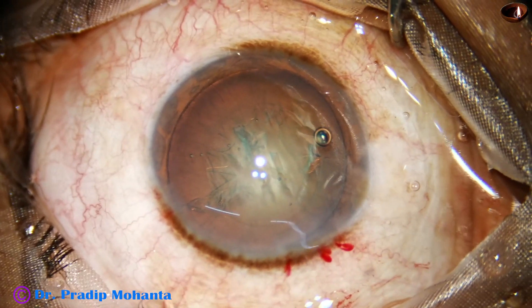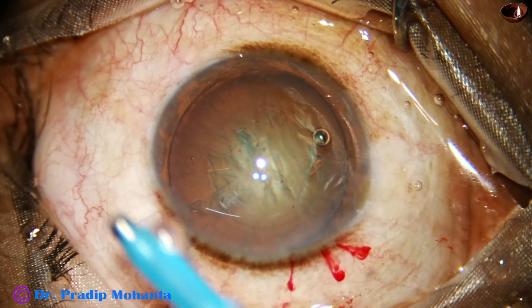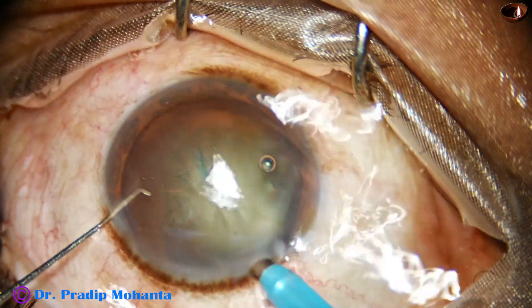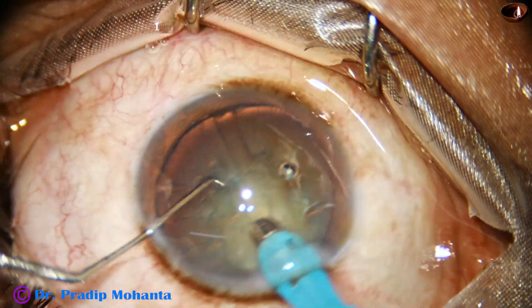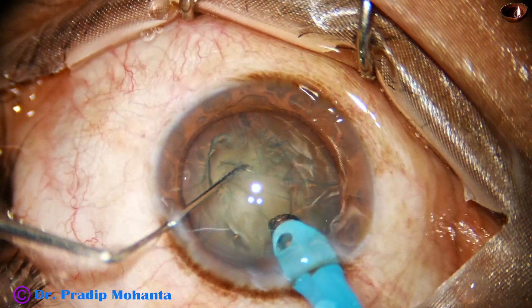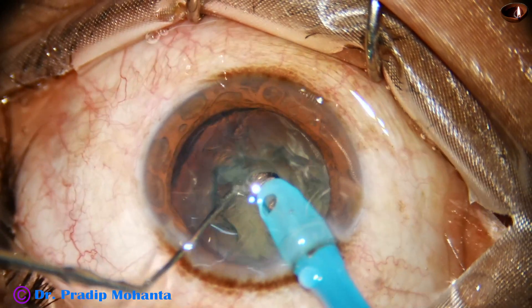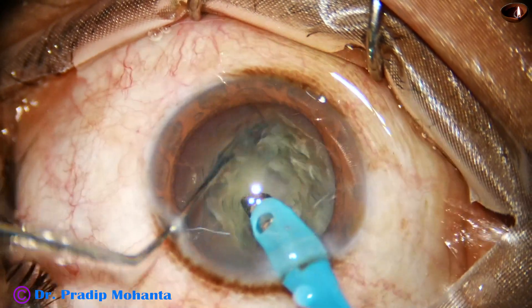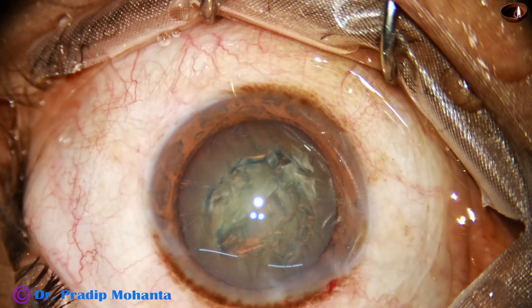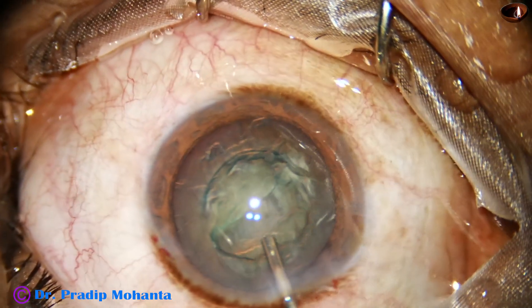I take the handpiece. My plan is to do a direct vertical chop in this case. But see what happens — I remove some superficial lens matter, then I bury the tip in the substance of the nucleus. As I try to chop, it doesn't happen. I didn't try one more time, because then use of the pre-chopper will be difficult.